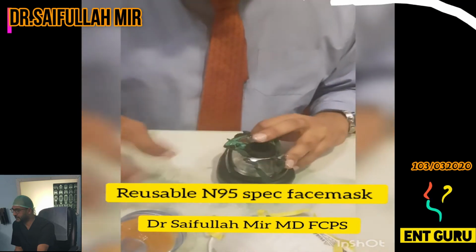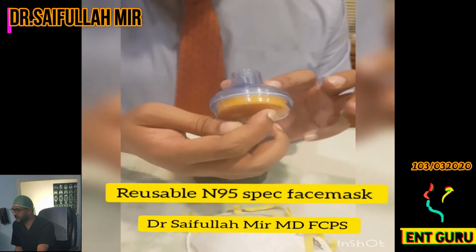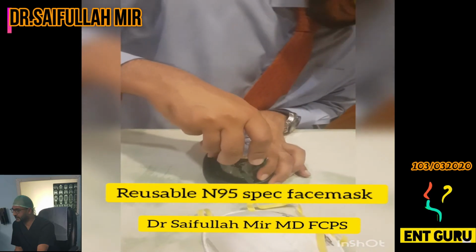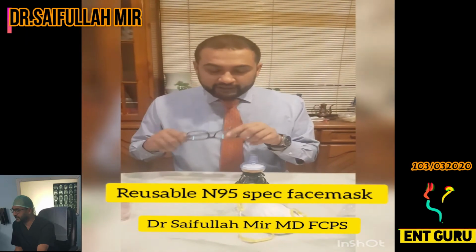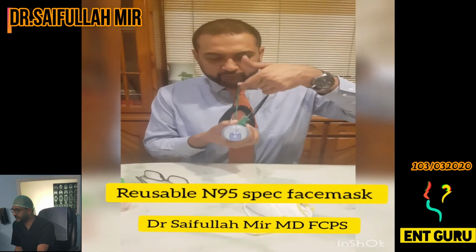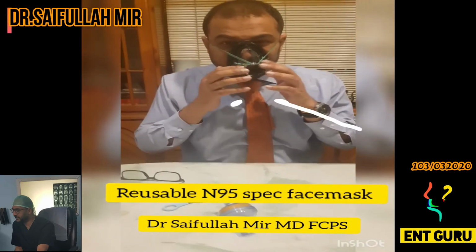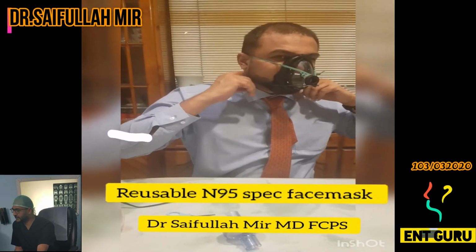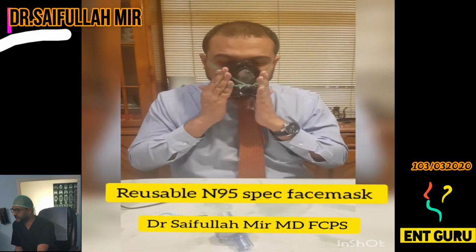Okay. And then you attach the HME filter. So the yellow side goes in, the white side goes out. You attach the filter as such. And now you are ready to don the mask. For donning the mask, you have to take your glasses off, together upwards with the mask on. This is how you don the mask. The light green string goes to the top, this one goes to the bottom. Make sure there's a tight fit.